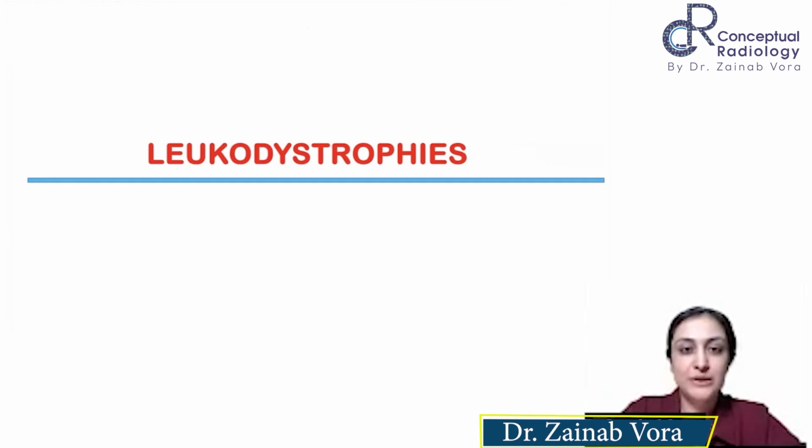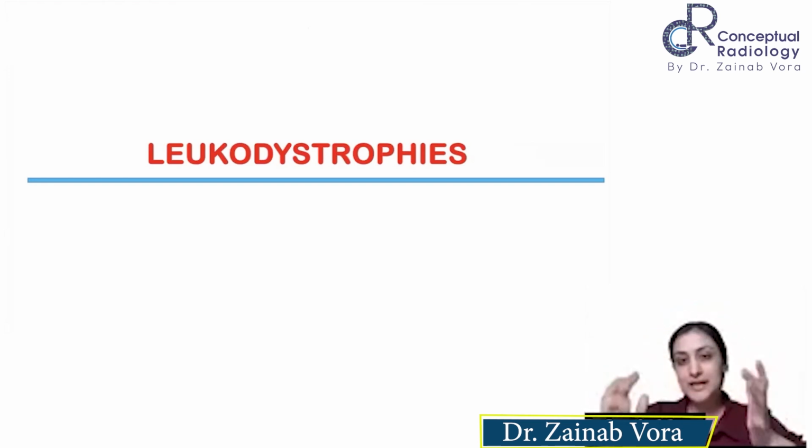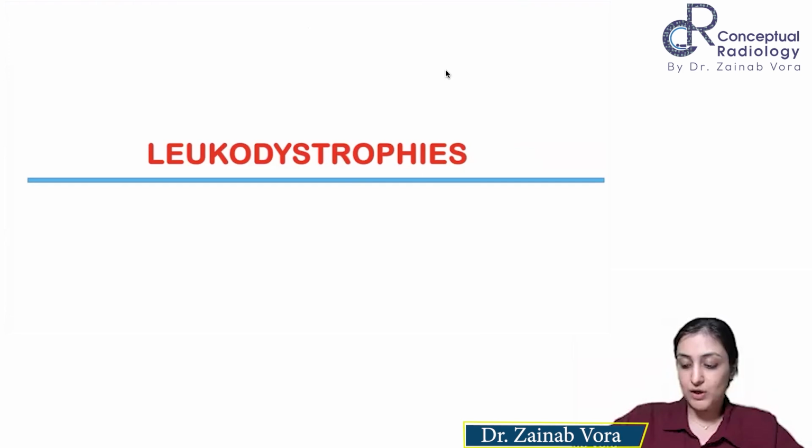So today's class is going to be on leukodystrophies. A pretty difficult topic, I'd say, but I'm going to try and keep it simple. I'll tell you the pattern approach that you should have, and what the specific pointers are which will help us reach the diagnosis. That's what the target would be.